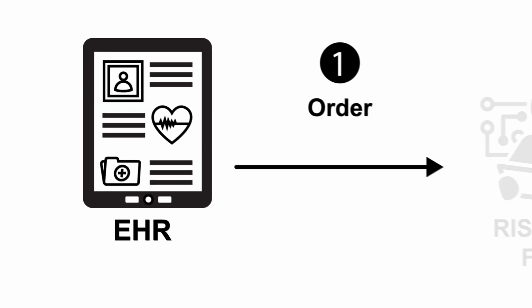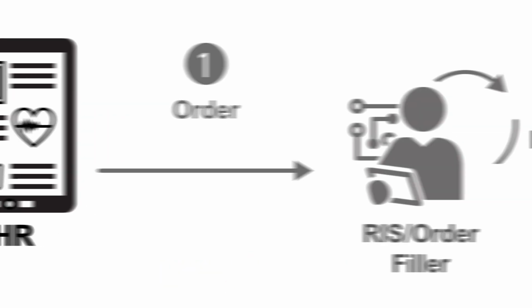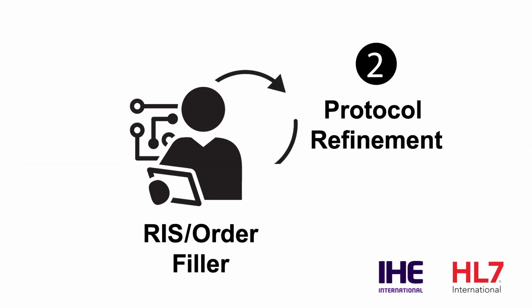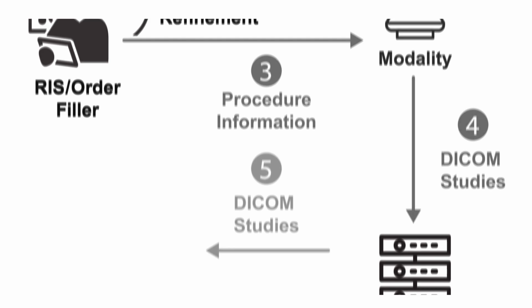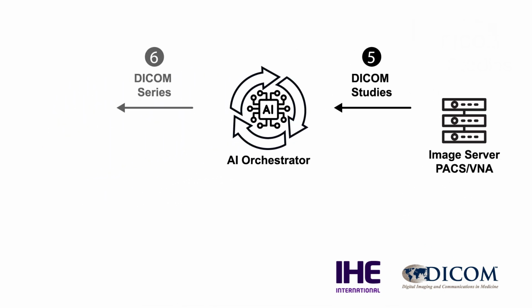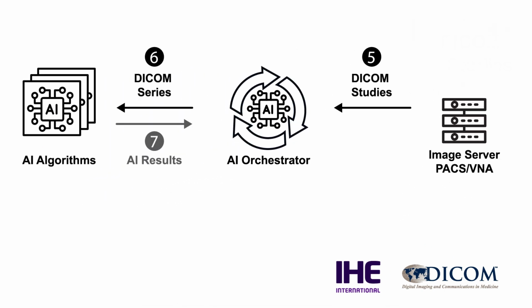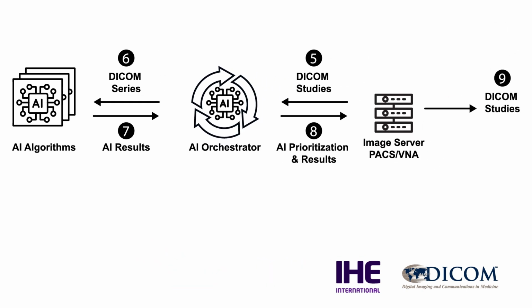Let's take a look at sample ways AI can improve the radiology workflow. Prior to image acquisition, AI facilitates protocoling, making it faster and more consistent. At image acquisition, AI aids in the reconstruction of MR images, an intense area of research. Algorithms aid in enhancing MR image resolution, reducing scan times. An essential component for successful AI implementation is the AI orchestrator, or traffic cop. The orchestrator streamlines integration of AI tools, making sure the correct imaging exam is presented to the right AI model. The AI orchestrator returns the results to the correct system.